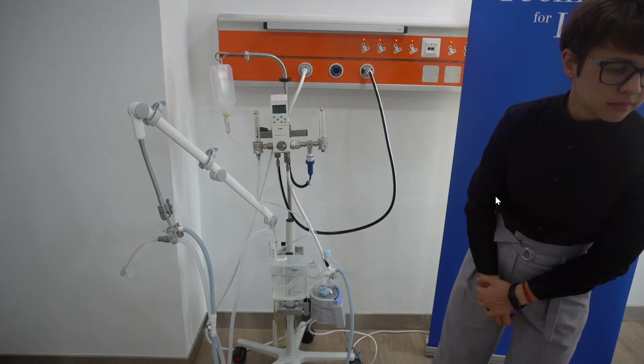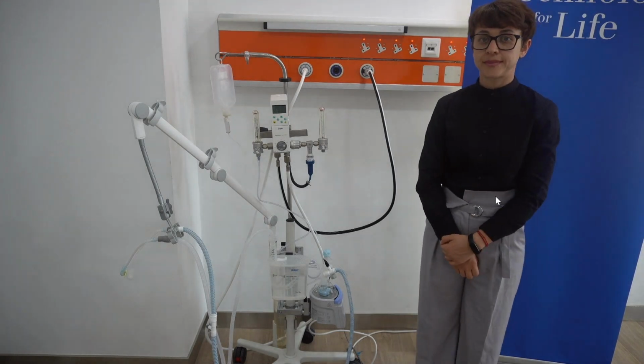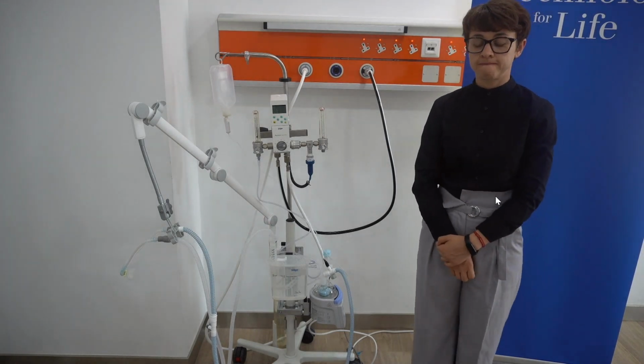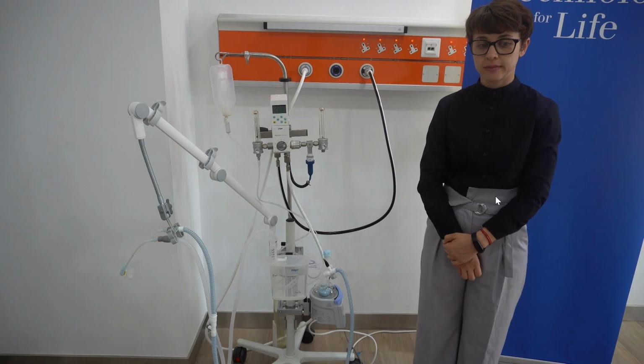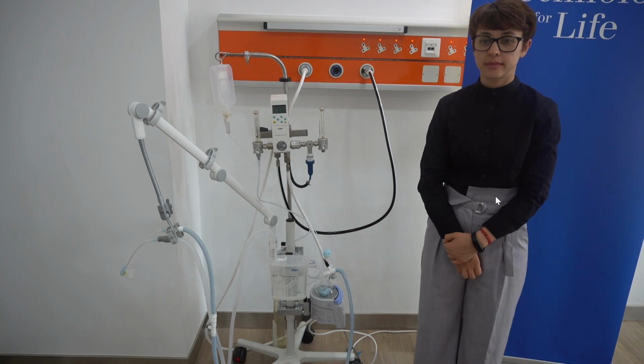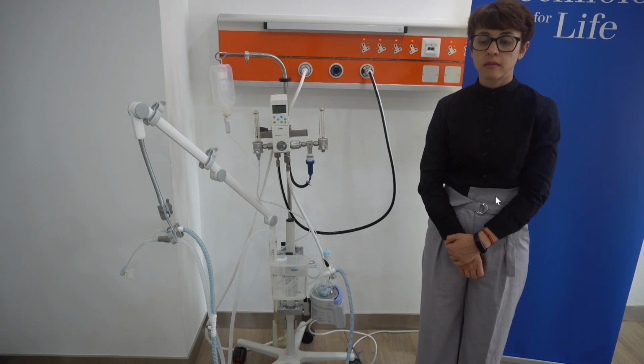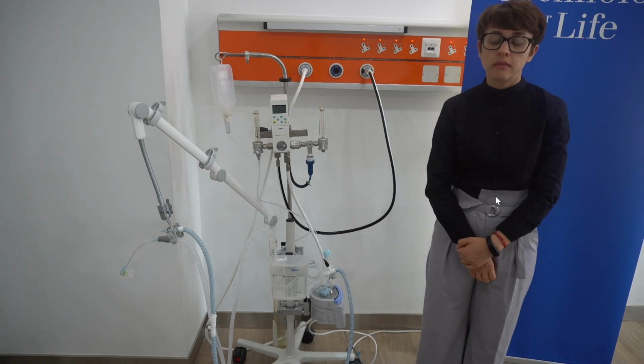The idea with the LISA method and the CPAP is to try and get the baby off the oxygen as quickly as possible. A lot of babies are coming off within 48 to 72 hours, and there's no need then for a filter. So we don't use filters in South Africa, very rarely. We change the circuit though, every 7 days.